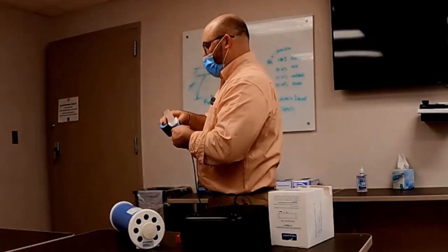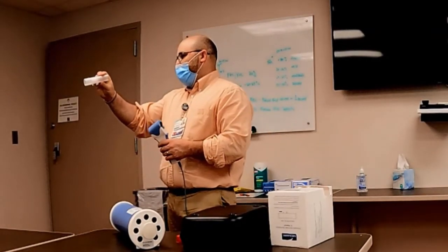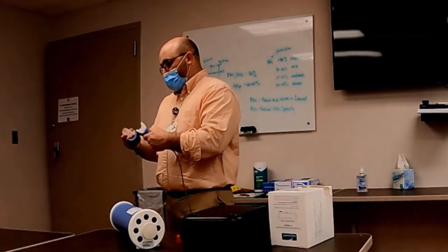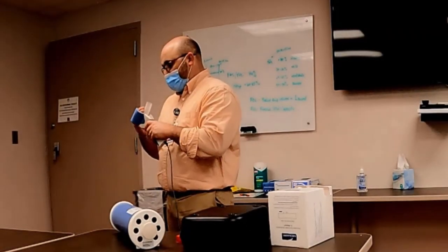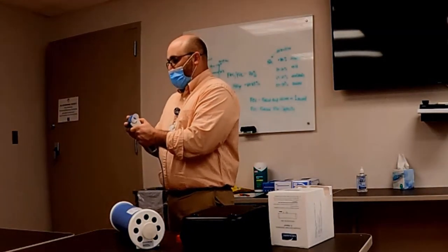How in the heck does it do that? Well, it's really cool how it works. There's like a little honeycomb down the center there. And so the changes in flow and the pressure as it goes through there, that's how they get all the numbers. So it's pretty technical, although it looks kind of El Cheapo, it actually is pretty technical.